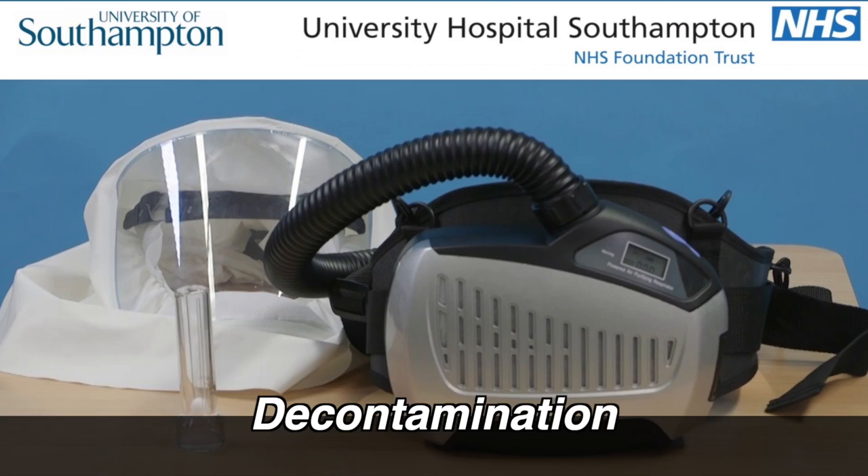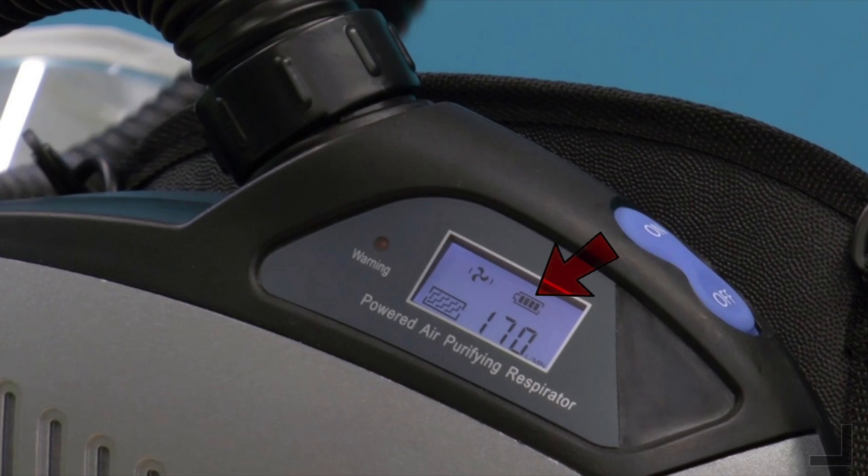Before each use, check the battery is fully charged. There is a battery indicator on the display screen which shows all four bars when fully charged. The battery lasts for eight hours and must be recharged when the low battery alarm rings.